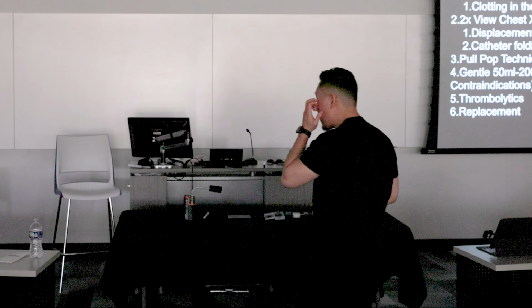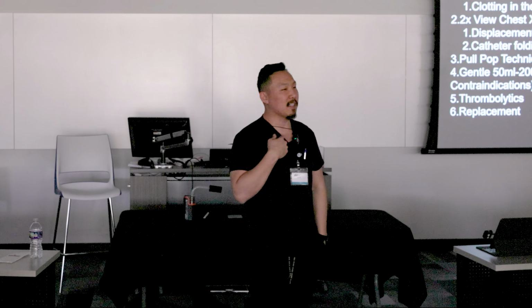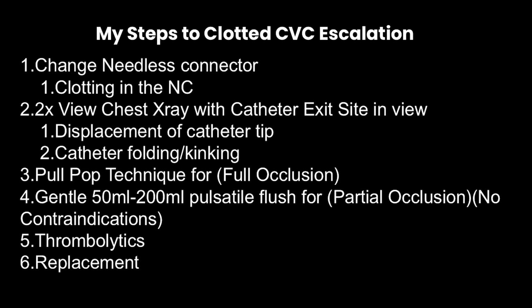All right, catheter thrombosis. Oh boy! Here are my personal steps of escalation for clotted CVC. First, I change the needleless connector because that's the easiest, cheapest way to fix this issue and pretty common.